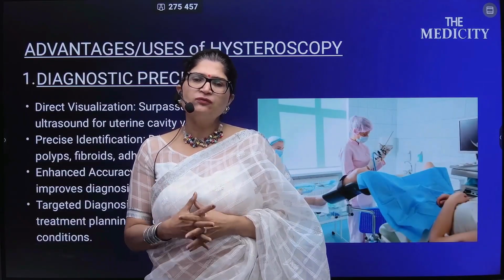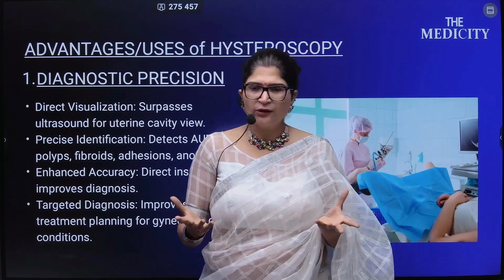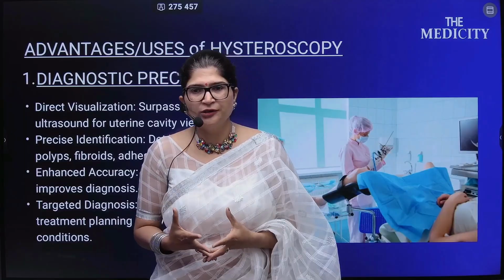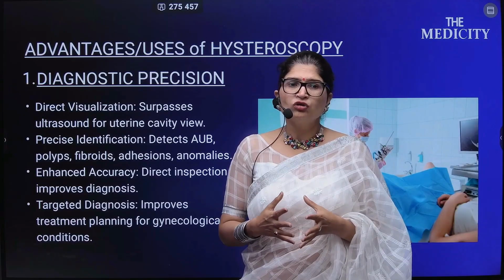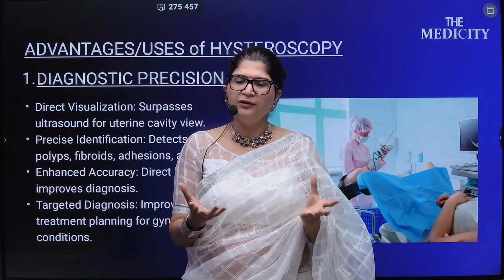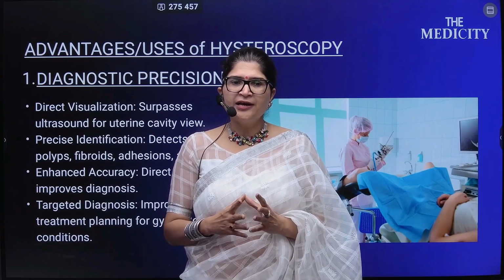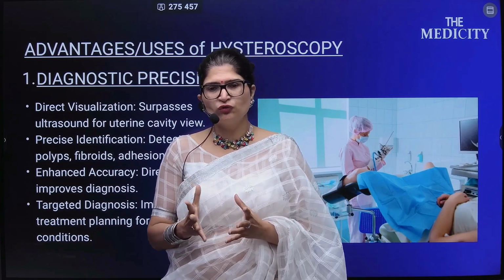So, the advantages of doing a hysteroscopy in your OPD chambers. Number one is diagnostic precision. You are directly visualizing the cavity, so you surpass the need for ultrasound. The ultrasound might miss some conditions which on hysteroscopy, by directly visualizing, we can detect very well. Fibroids, adhesions, polyps, and septum can be very well identified. So it gives you enhanced accuracy by directly inspecting and making a definitive diagnosis. Targeted areas can be visualized for any gynecological condition, and even for taking biopsies or tissue for histopathological examination.